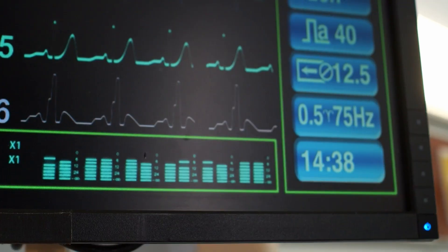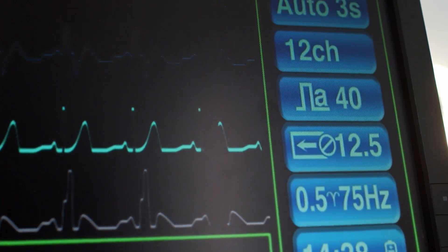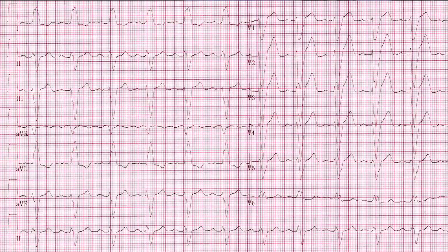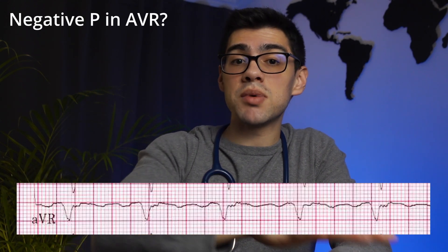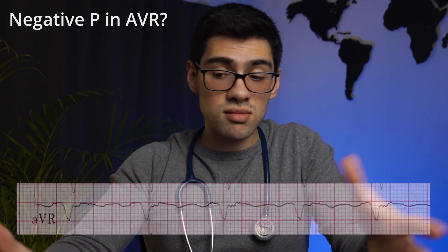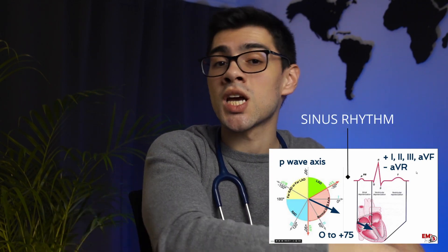The last rule of thumb to master EKGs is to analyze one thing at a time. When you're first starting out, a complex EKG can be quite intimidating — you see a bunch of stuff going on everywhere and your first instinct is to say it's just too much. The solution is to use a system that makes you focus on one thing at a time. Forget about all the mess and just answer a specific question such as: is there a positive P wave in lead II? Is there a negative P wave in lead aVR? If yes, you've just confirmed that the P axis is normal and therefore the rhythm is coming from the sinus node. Then you move on to answer other specific questions.